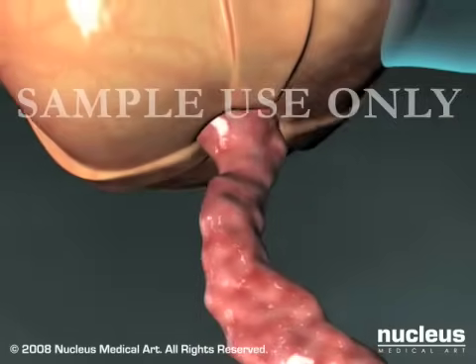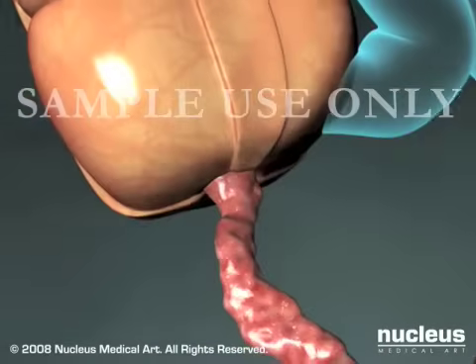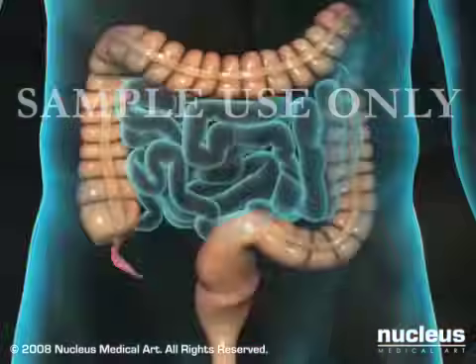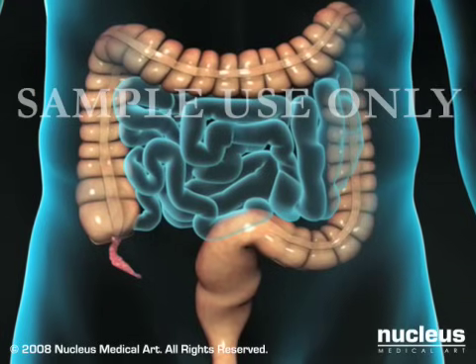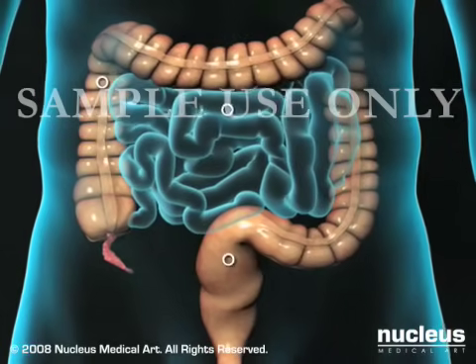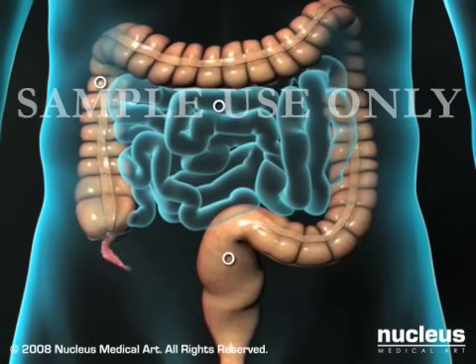The only treatment for appendicitis is appendectomy, which is almost always performed on an emergency basis. Newer laparoscopic techniques require only tiny keyhole incisions or puncture wounds, which generally result in a shorter recovery period.